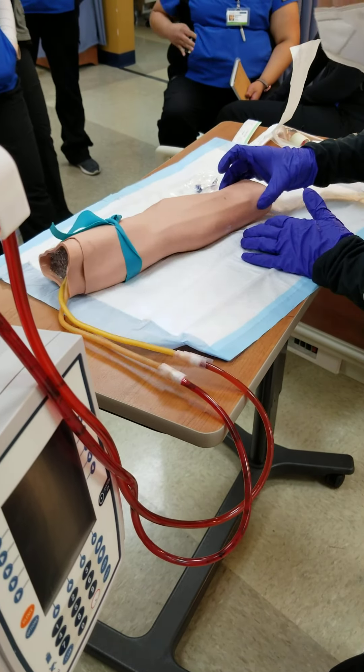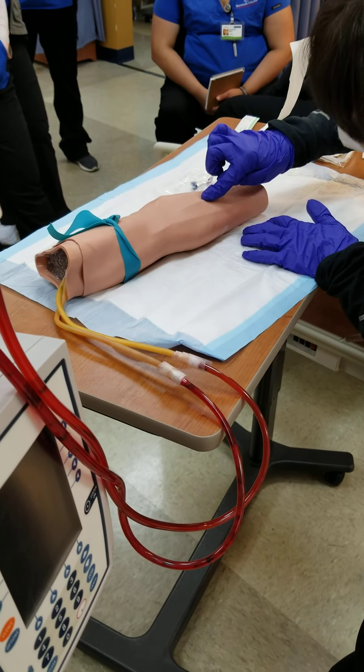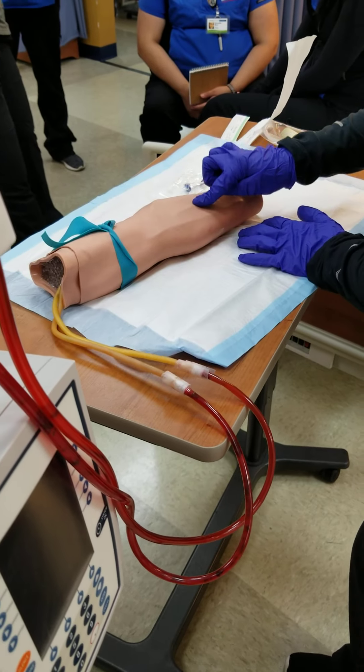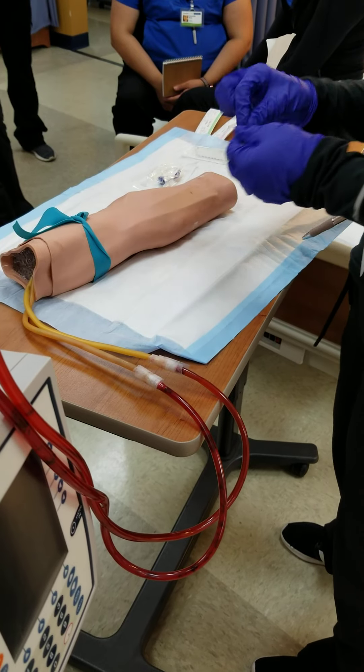I think I'm going to be able to see if I do this one right here. And it looks like the easiest one, to be honest with you. And watch me miss. So it should be bouncy. Let's take off that position.